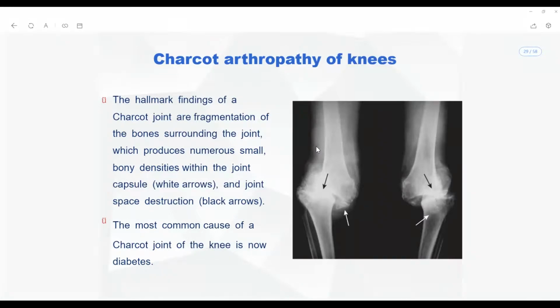And this one is now diabetes. This is a clinical condition of diabetes where there will be angular deformities, and increased density of the subchondral sclerotic regions. And yes, you can call it a subluxation. But technically, subluxation is the extension, hyperextension or hyperflexion of the joint, perpendicular to the line.